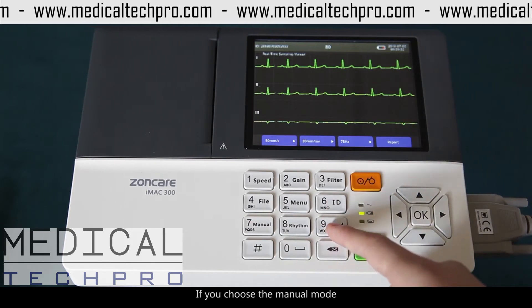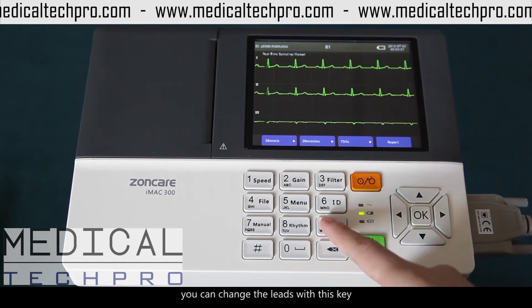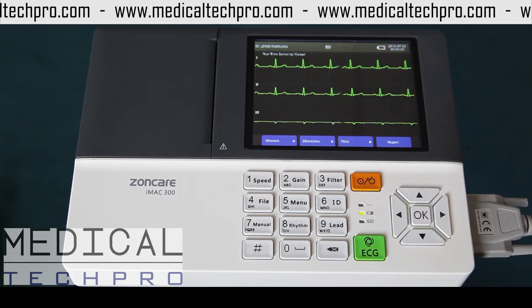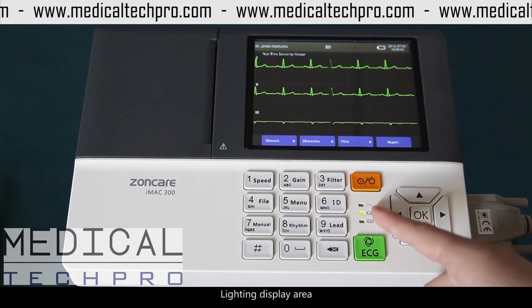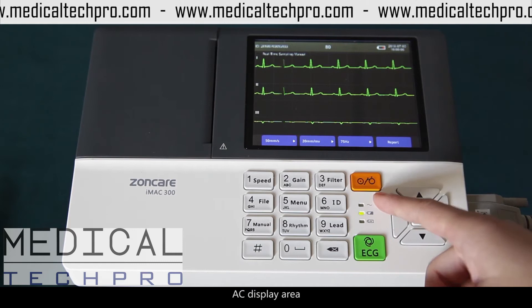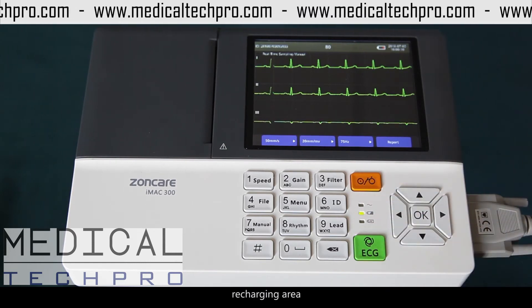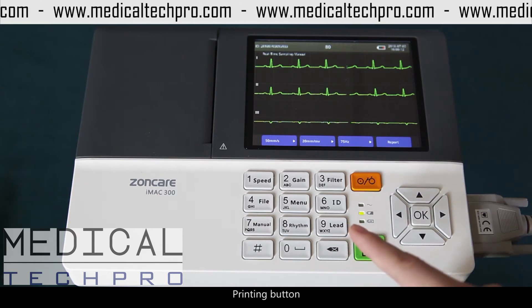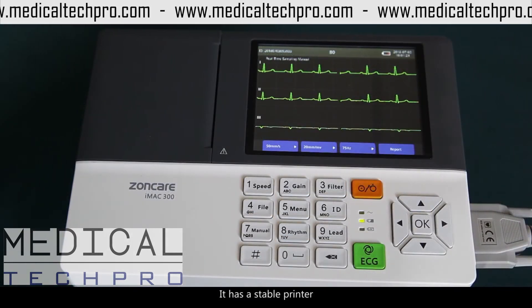9. Lead — if you choose the manual mode, you can change the leads with this key. 10. Power button. Lighting display area. 11. AC display area. 12. DC display area. 14. Recharging area. 14. Printing button.